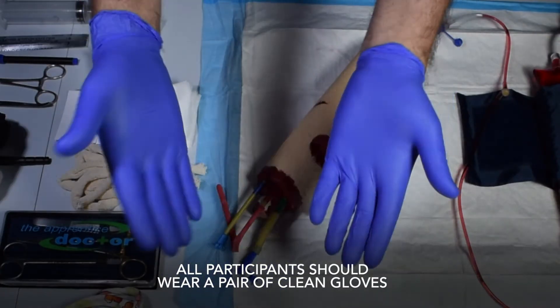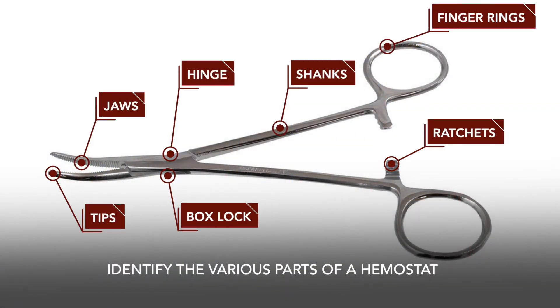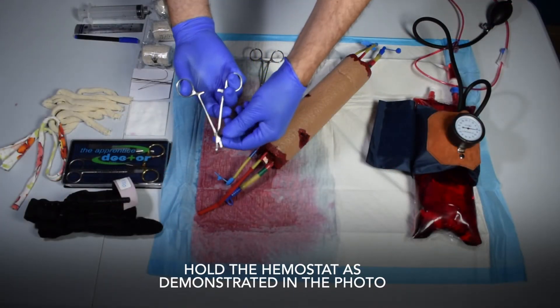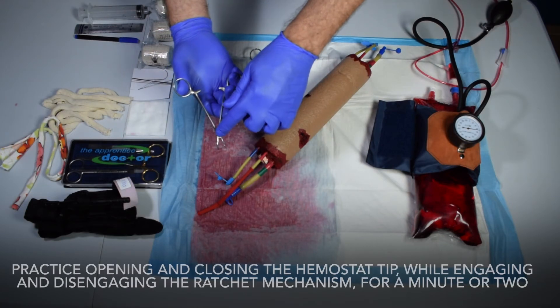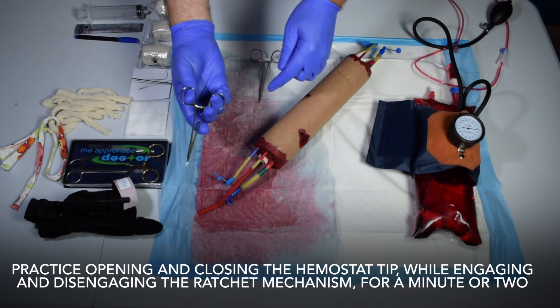All participants should wear a pair of clean gloves. Identify the various parts of a hemostat. Hold the hemostat as demonstrated in the photo. Open and close the latch mechanism. Practice opening and closing the hemostat tip while engaging and disengaging the ratchet mechanism for a minute or two.